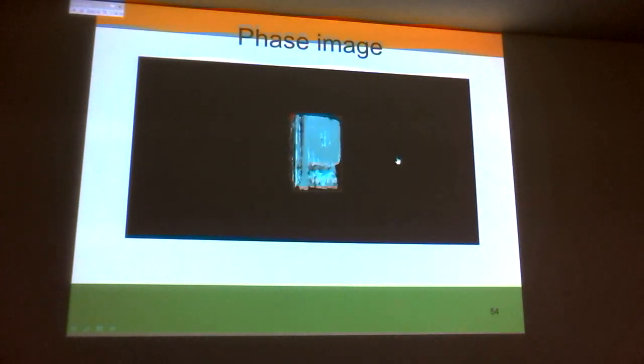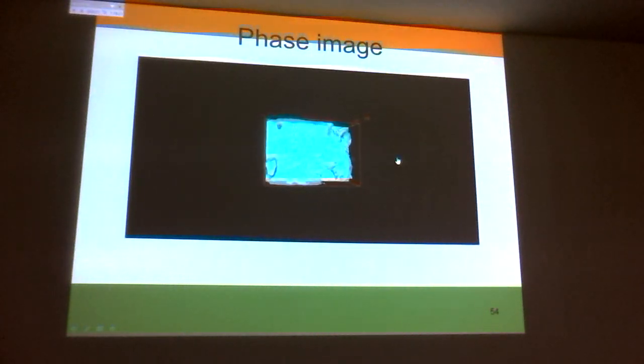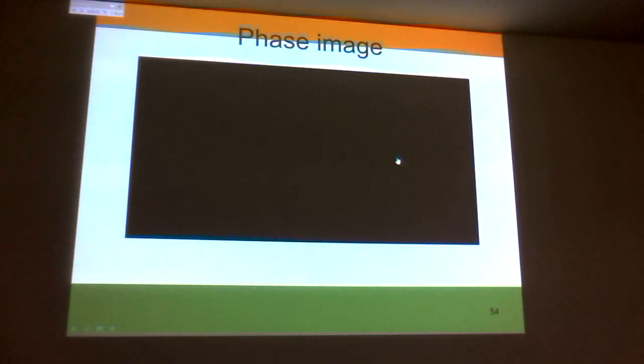So Andreas, I think I have the same question that Adrian asked before. In order to make the identification of depth, to say this is 300 microns below a surface, you have to assume certain properties. Yeah, the diffusivity or the diffusion times or something like that. Which you don't know. How do you know it's right? You don't know, but what you do is repeat these measurements and try to optimize your signal. We know what the thermal diffusivity of bone is, because it's been measured.